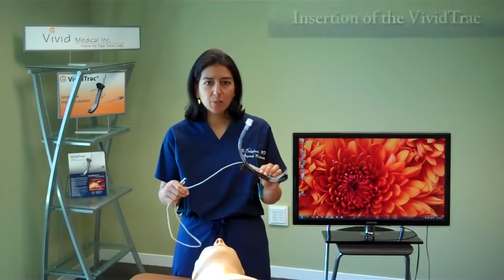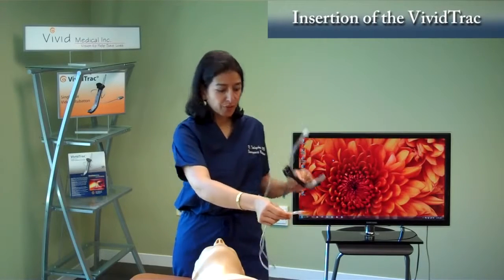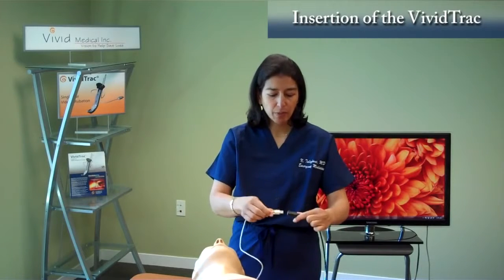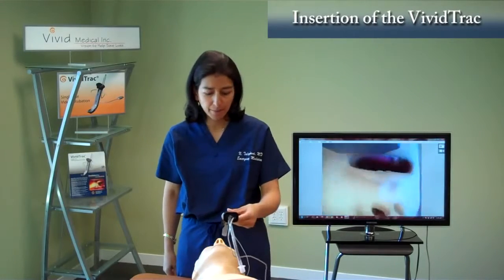Okay, so now that the device is preloaded, let me show you what you do next. You take the USB cable that's part of the device and you plug it into the USB port of your computer, or as in this case, to an extension cord from your USB port. As soon as you plug it in, you will see that our free software immediately pops up on your screen and you're ready to intubate.